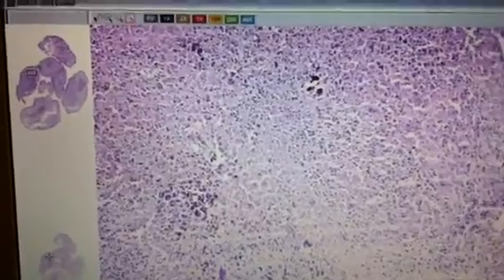And it's basophilic infiltrate, so you would think that it's a bacterial infection or something, but it's not. I don't know why they would say that. Oh yeah, I'm sorry, I mean the basophilic foci look like there's a bacterial infection, but there is none. Of course. Okay.